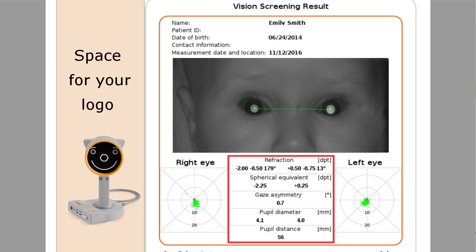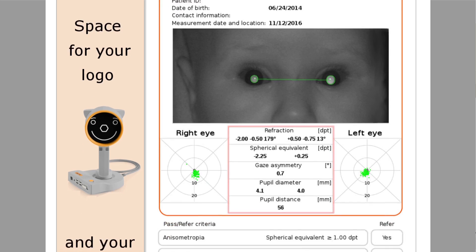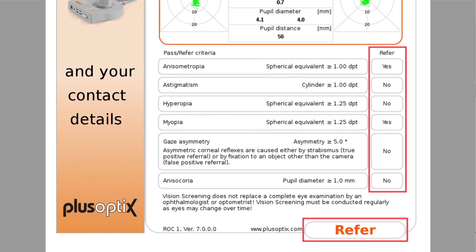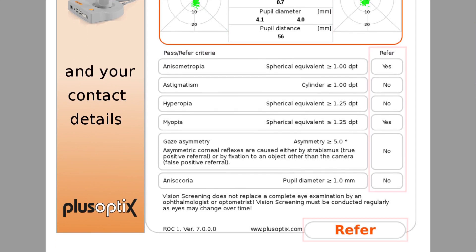Ophthalmologists often use these measurement values as input values for further treatment. Please note that these measurement values cannot be used for the prescription of glasses or contact lenses. An evaluation, as well as the screening result, is displayed below the measurement values.